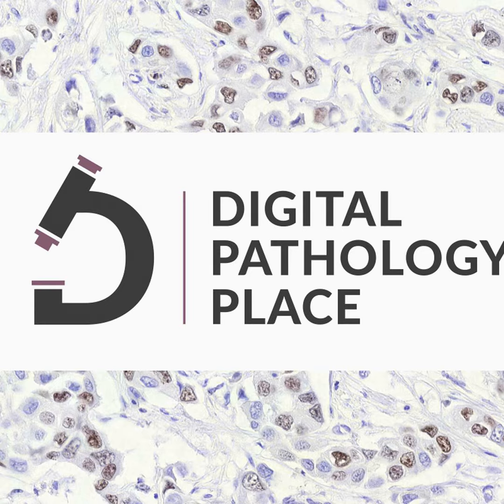But they had over 100,000 glomeruli light microscopy images to develop this AI-assisted diagnostic model. And the AI had these 3 components. First, a glomerular localization module for segmenting glomeruli. So the model recognizes glomeruli in the kidney, and then we have a feature extraction and fusion model for glomerular lesion.